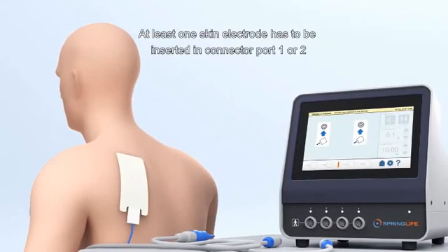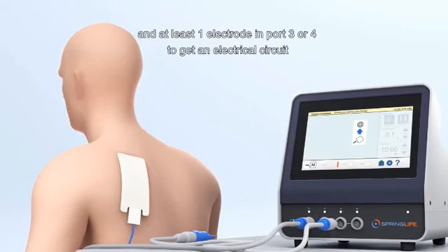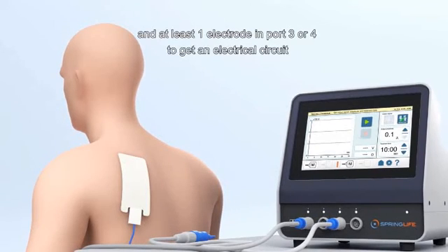At least one skin electrode has to be inserted in connector port 1 or 2 and at least one electrode in port 3 or 4 to get an electrical circuit.